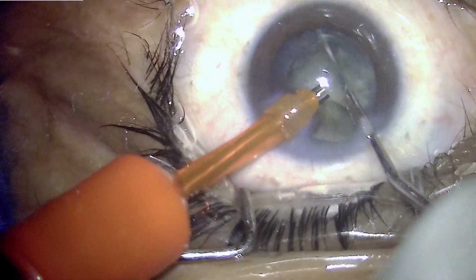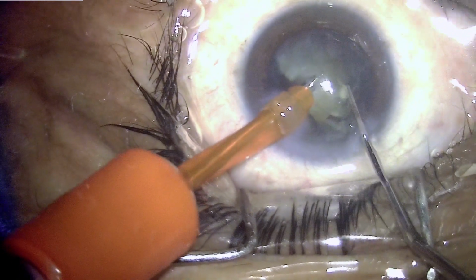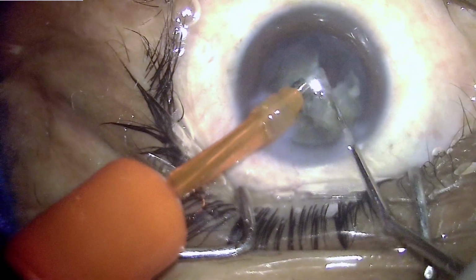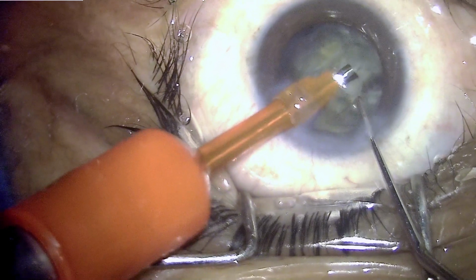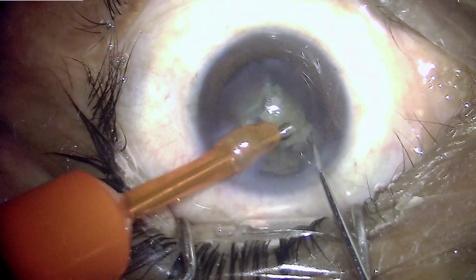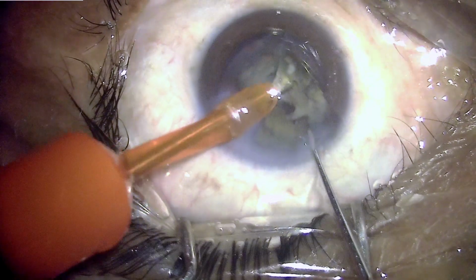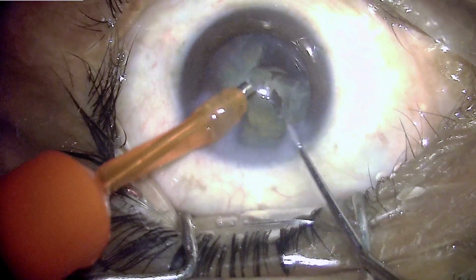The nucleus is being chopped into smaller and smaller pieces, and this is important because this will facilitate the removal of the nucleus without interfering with the corneal tissue, because I believe that larger chunks tend to prolapse into the anterior chamber and may rub over the endothelium, which I find is the most important tissue which can cause post-operative corneal edema and keratitis.